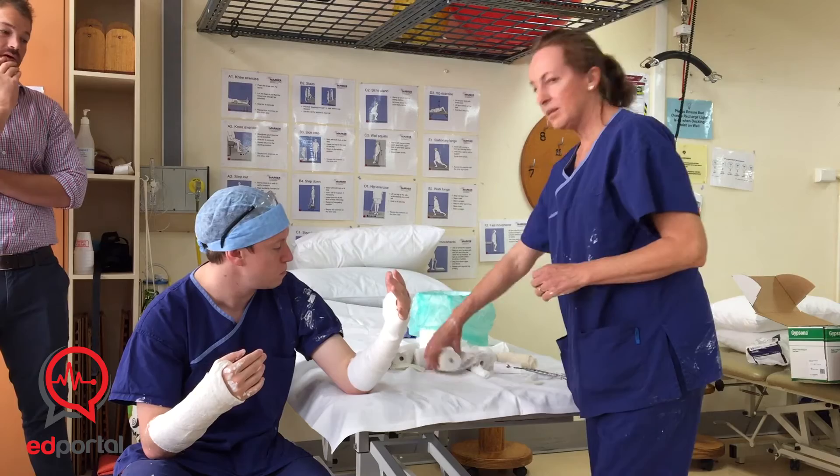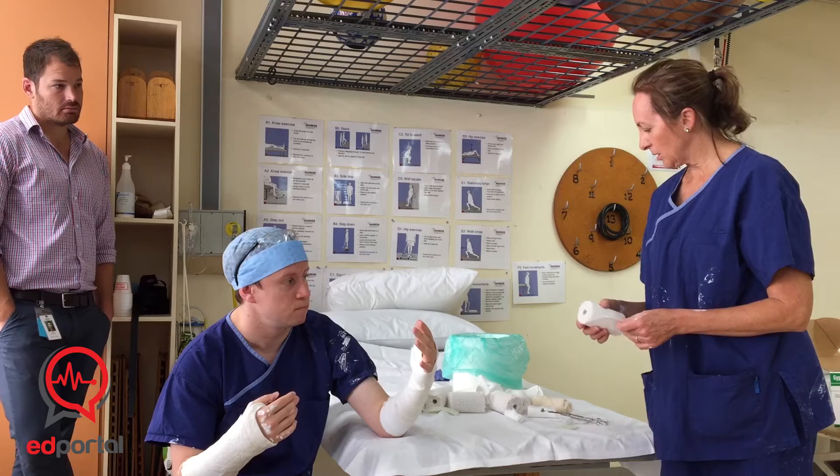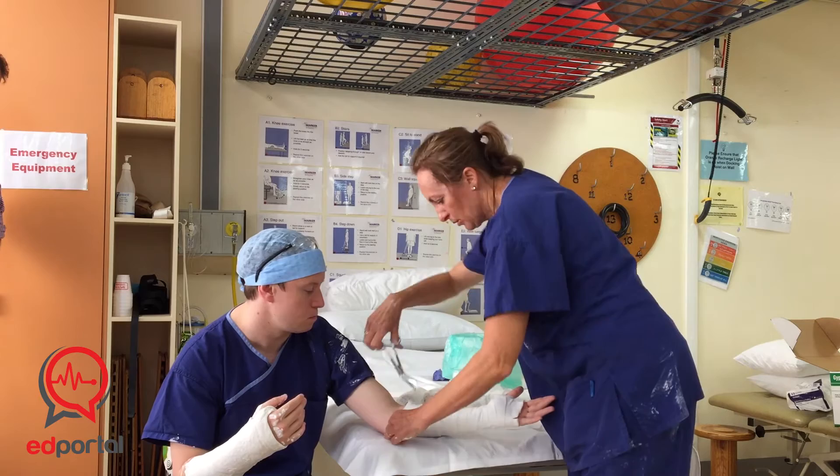A common question is: how many layers for a slab? Well, that's very dependent on the person. If you had a teenage boy, you might end up using one and a half to two rolls to make it nice and thick. But a little old lady, one roll is plenty. Just gauge it on the person you're dealing with — it's quite a heavy cast for some people to manage.